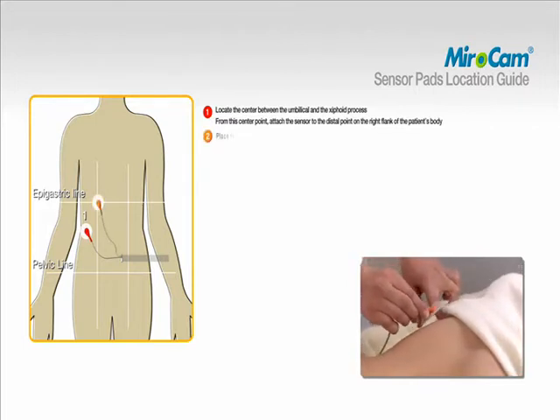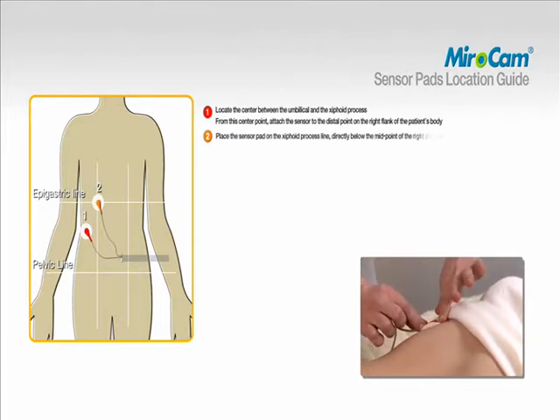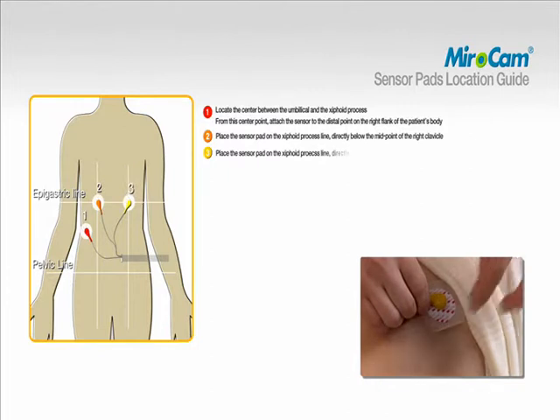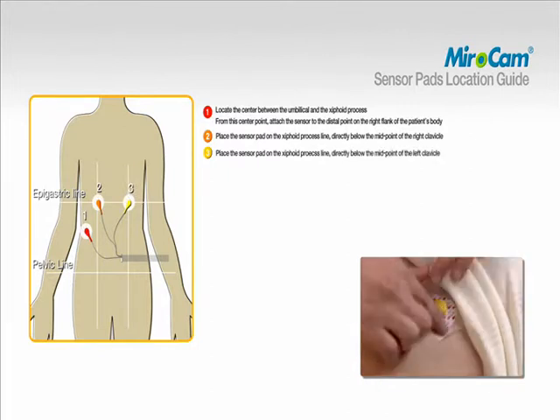To attach pad number two, place the sensor pad on the xiphoid process line, directly below the midpoint of the right clavicle. To attach pad number three, place the sensor pad on the xiphoid process line, directly below the midpoint of the left clavicle.